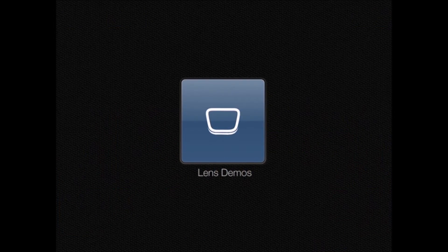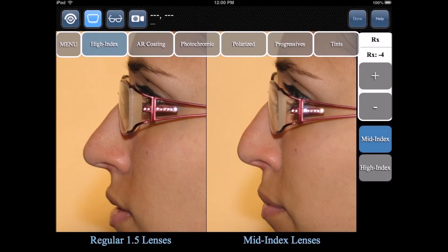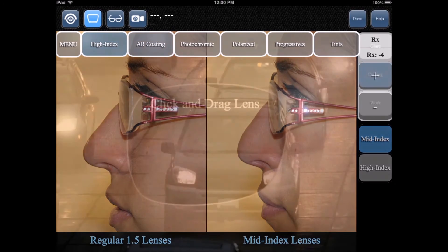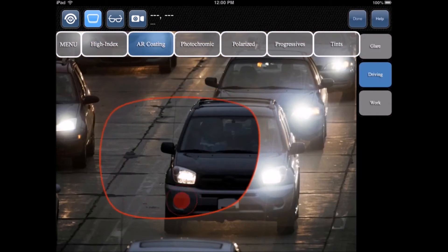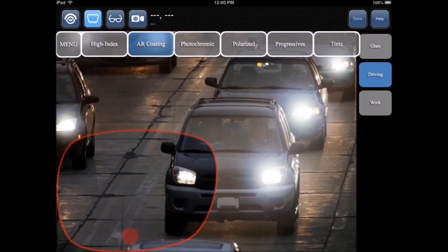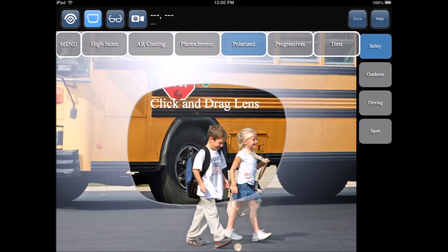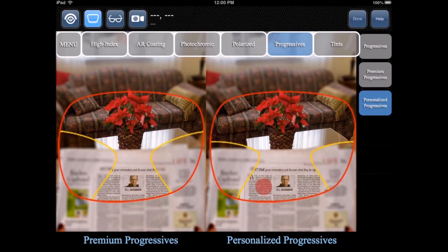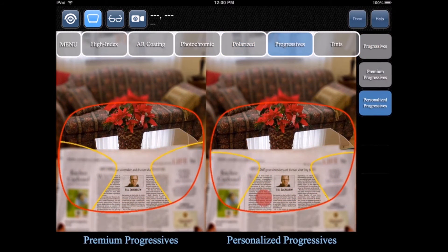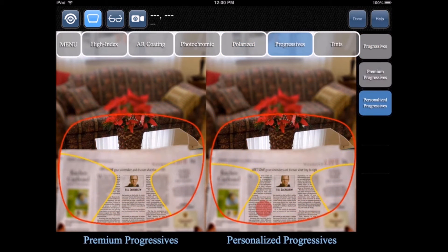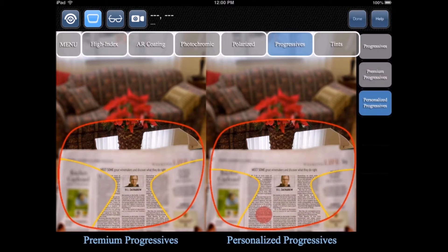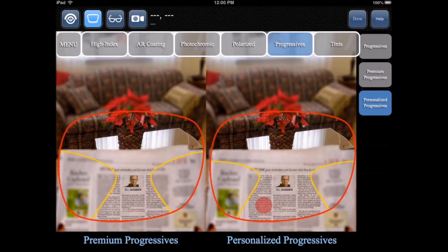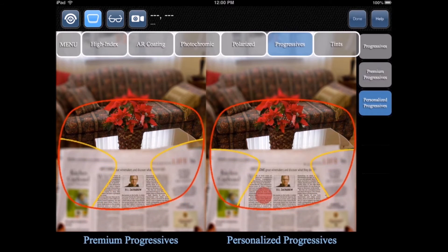The lens demos module allows you to demonstrate the advantages of premium lens options in a quick and interactive way. The demos can be navigated by touching the lens options at the top and sub-options on the right-hand side.